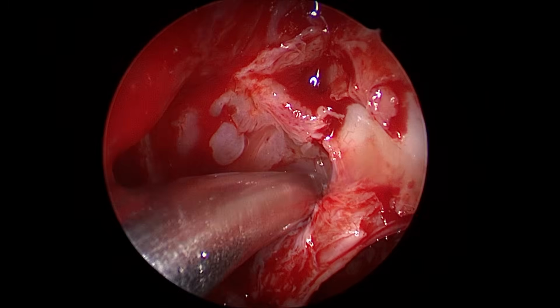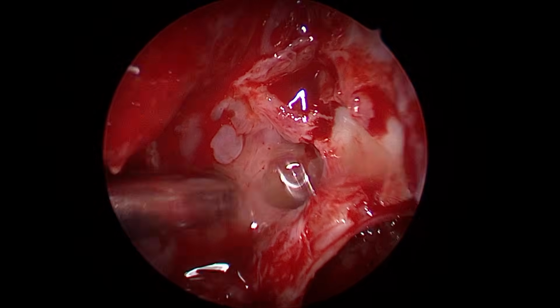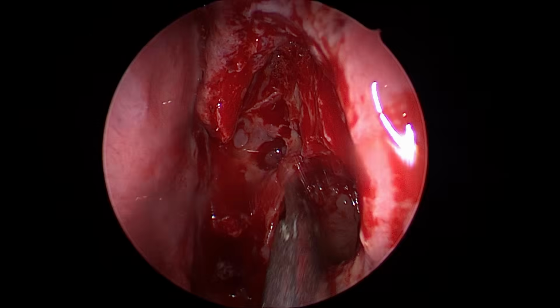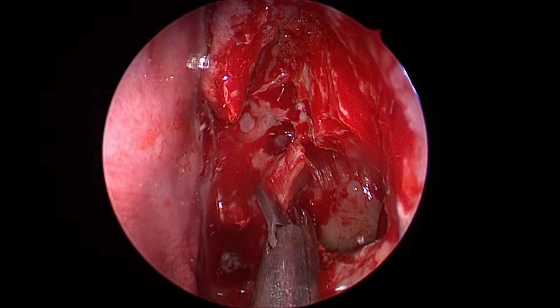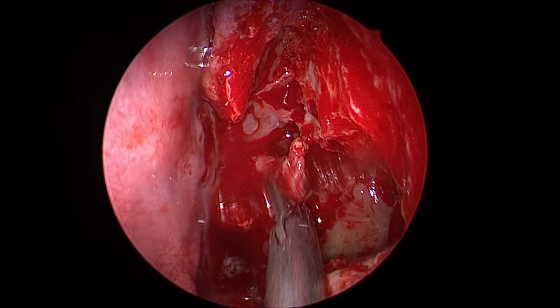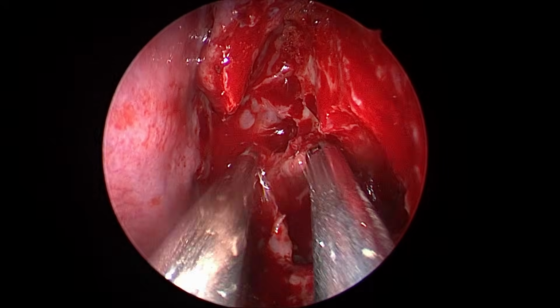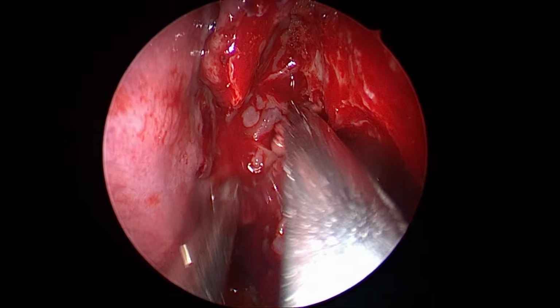See this? Give me the thorough cut here. I should give a thorough access for the steroid to reach thoroughly.